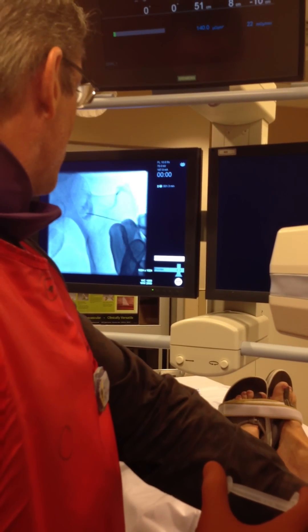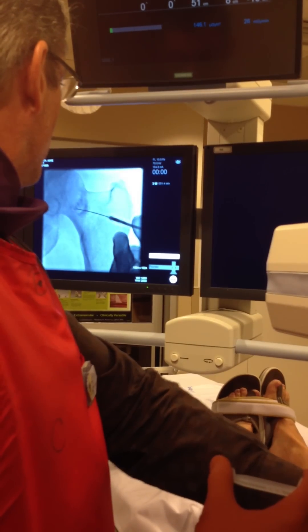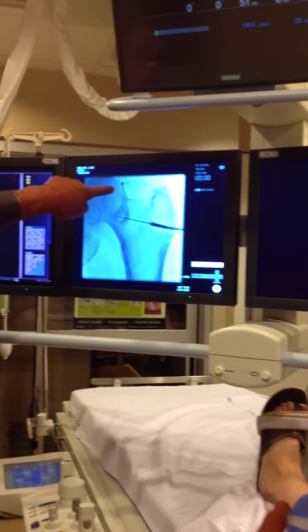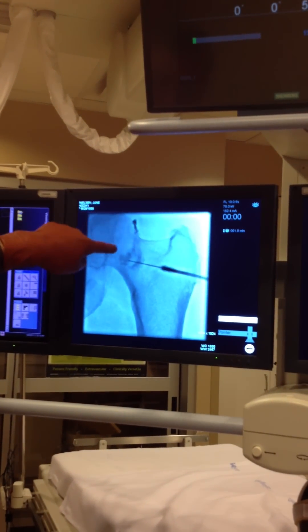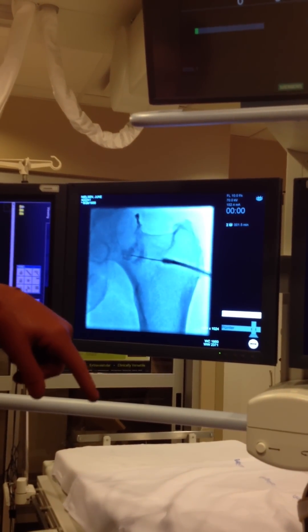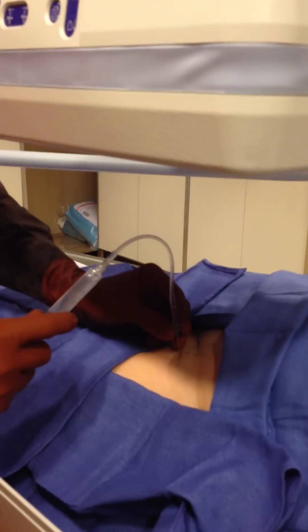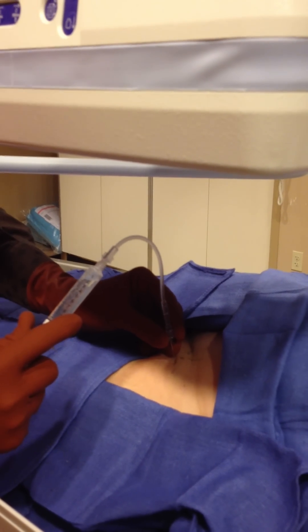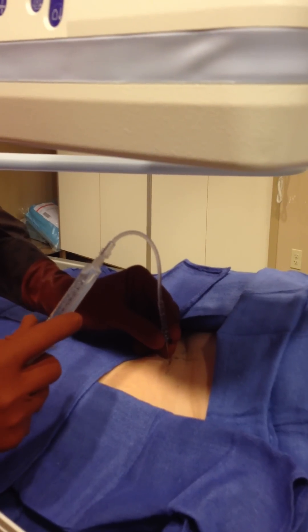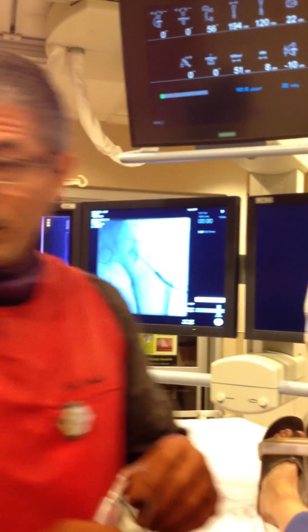Sometimes it's five seconds, sometimes it's five minutes. There — see that? See the contrast now flowing? That's what you're looking for — contrast that flows around the femoral neck up towards the femoral head. You don't really need to put a lot of contrast in; it's simply to prove that you're in the joint. Maybe put a little negative pressure on at this point to see if you get joint fluid back. If you do, you can aspirate out as much as you can — it'll give them a little relief.